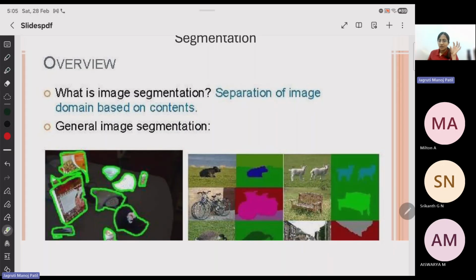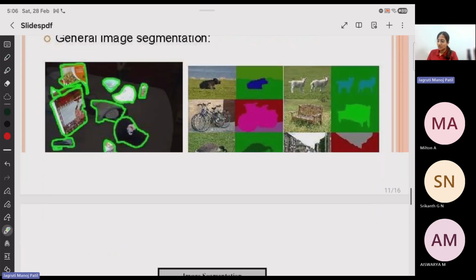You make a mask of it, take that mask, apply it to another image, and compare it with that image. Let's say you have a traffic-based data set, or you have a tumor in your organ. You try and see if that type of mask is matched, and thereafter it will scan through and give you cross-sectional images. In case of MRI, you'll get different slices, and you compare through all the slices. If you don't find it, then you go into much smaller local variations and see. That's how segmentation works.